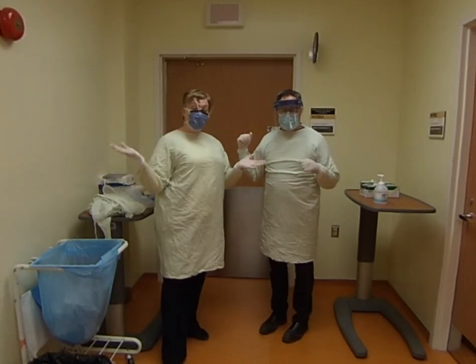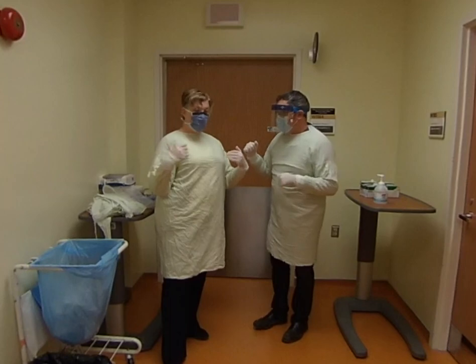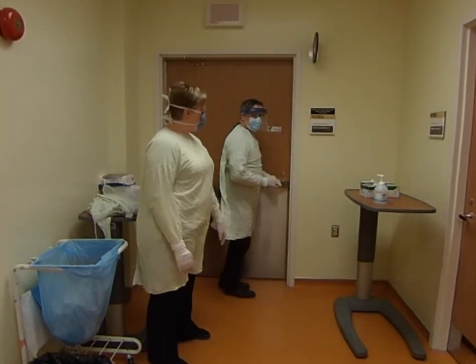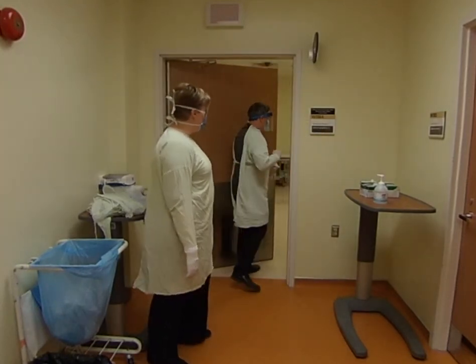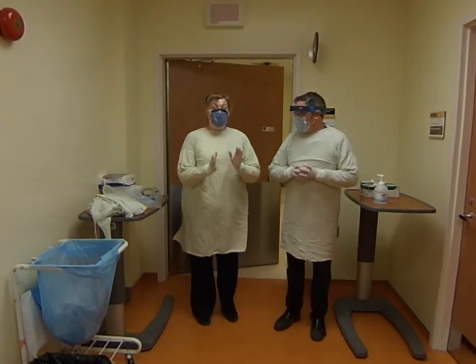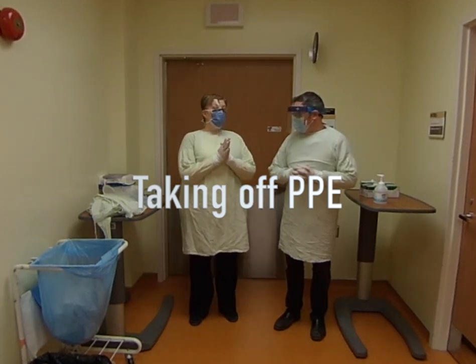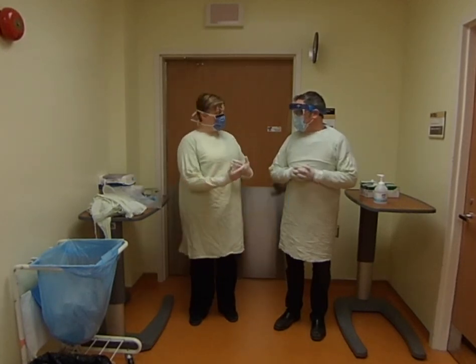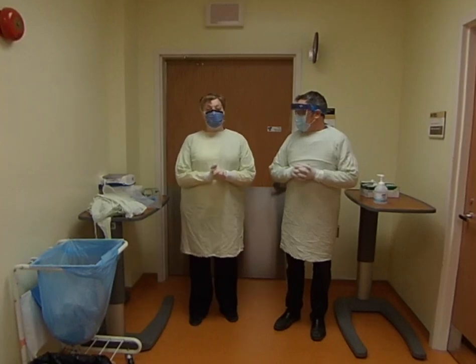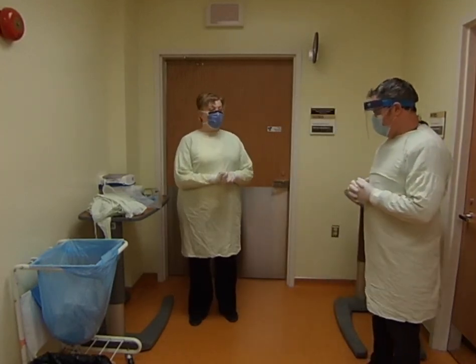You can see we look slightly different but we're still doing the same thing — protecting our face and body before we go in and see patients. So now we're going to take off our PPE. I'm going to take mine off first and explain to Glenn how to do it, and then Glenn will do his and I'll give him feedback as needed. The first thing you want to do is take off your gloves.